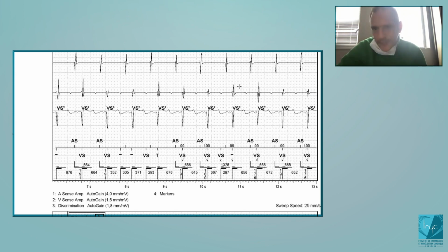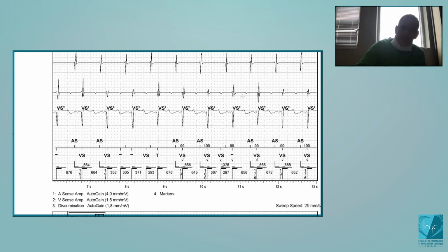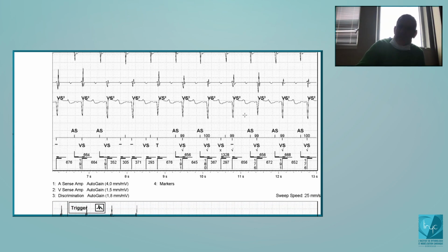And most of the time, the conditions are really different in terms of R wave and T wave and ratio between R wave and T wave. And you need to have simultaneous T-wave oversensing in both channels to receive an inappropriate therapy. Okay. And I think that's clearly a major advantage of this Secure Sense algorithm.